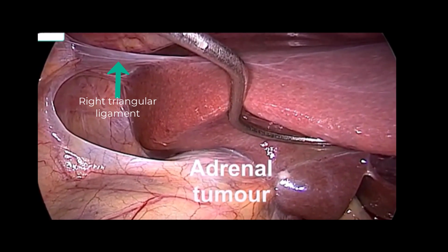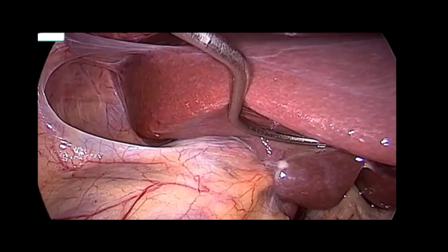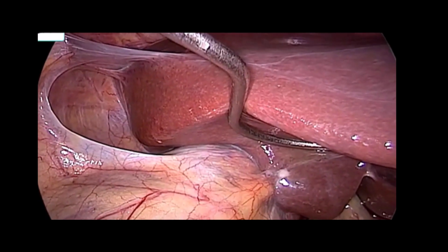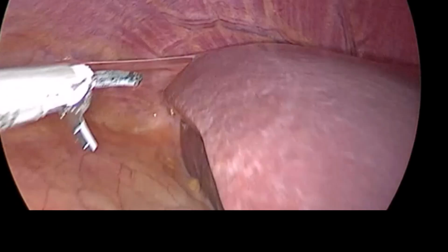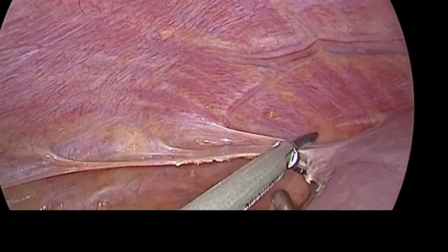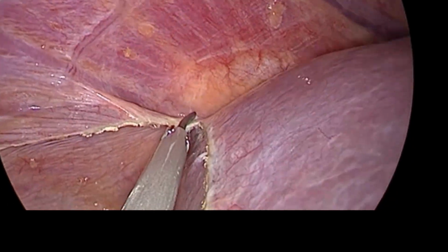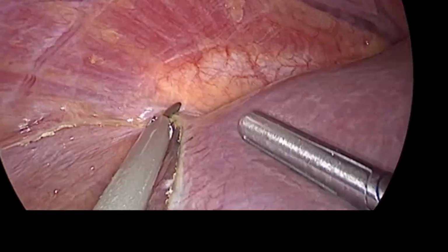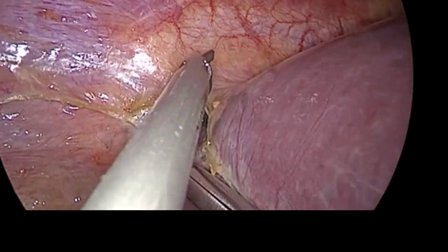You can see in this image that there is not enough tension to allow adequate retraction and distraction of the liver and vena cava from the adrenal gland medially, and the surgeon will most likely end up dissecting medially in a suboptimal manner. As I show here in this video from a different case, the right triangular and coronary ligaments are divided. Normally we want to grasp the ligament about 1 centimeter away from the liver to avoid tearing the liver capsule, pull it inferiorly and begin to roll it medially to bring that ligament to us, which will aid in continuing superiomedially to fully mobilize the liver.